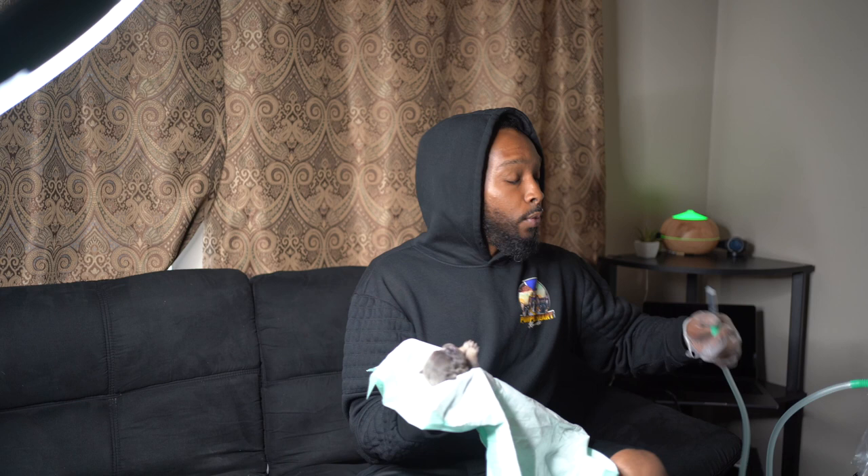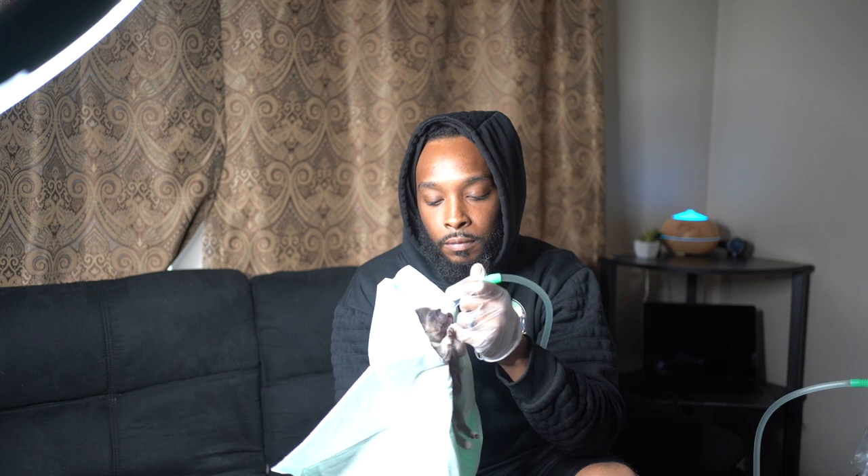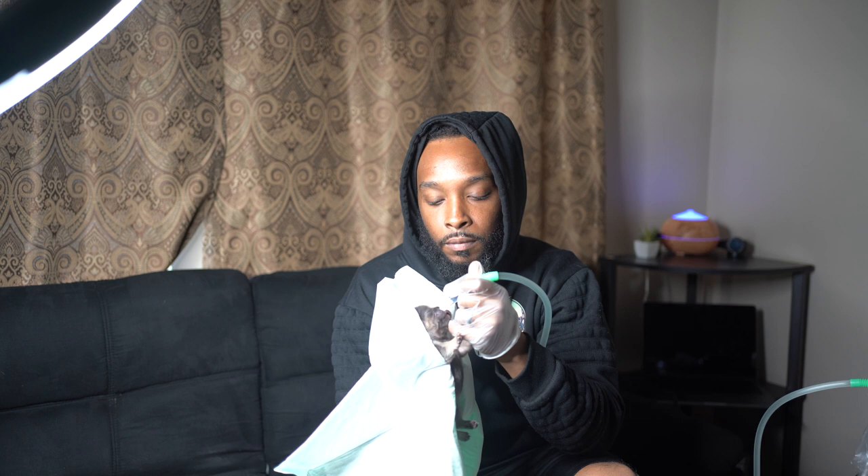All right, this is little Astro. He just opened up his eyes yesterday. He's been doing a lot better but is really congested — the bulb was just not working. So we're going to set this on the lowest setting and work our way up, just to see how much better this is than the actual bulb. Oh yeah, he don't like it. This is already collecting — the mucus is already collecting.